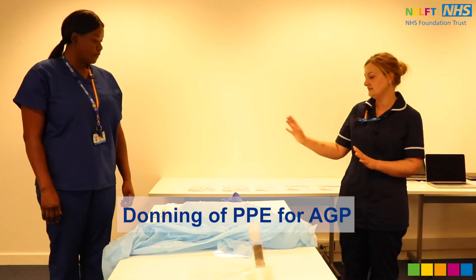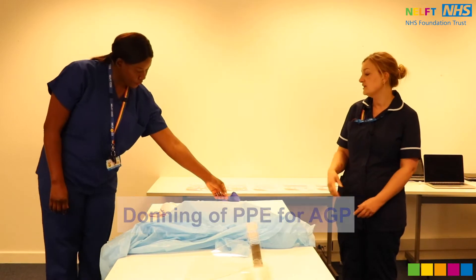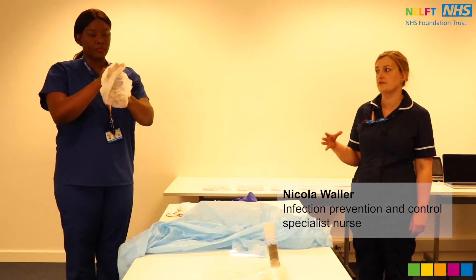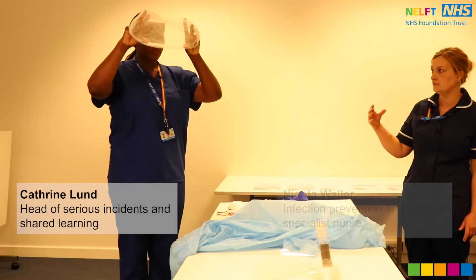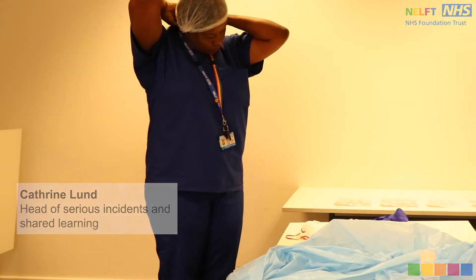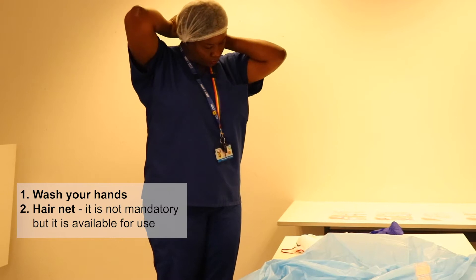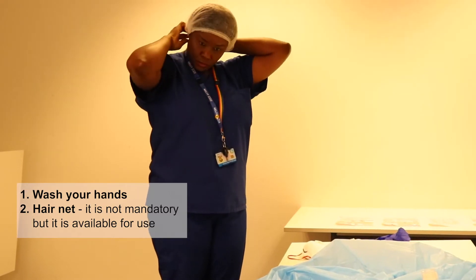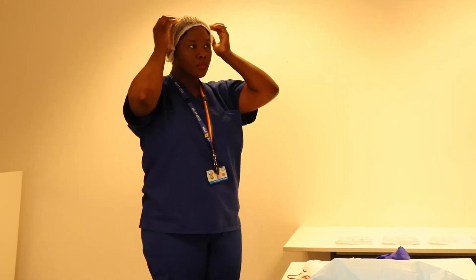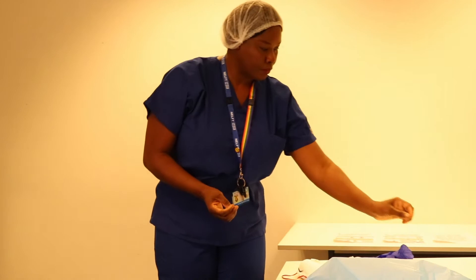We're going to demonstrate what you wear for AGP. If you choose to wear the hairnet — it's not part of the guidance but they are available in NELF — you can put that on first. You have already washed your hands at this point; that's the first thing you would do, wash your hands.